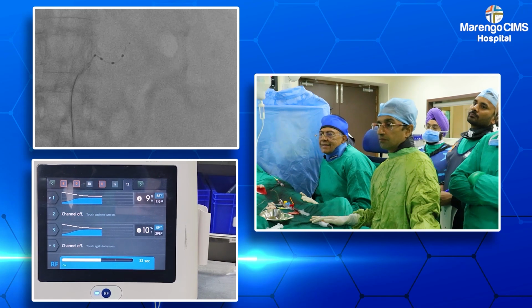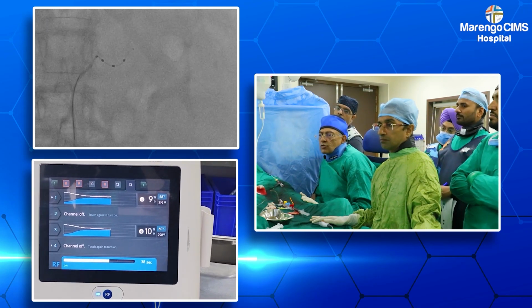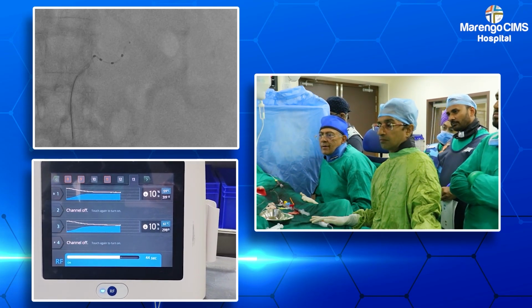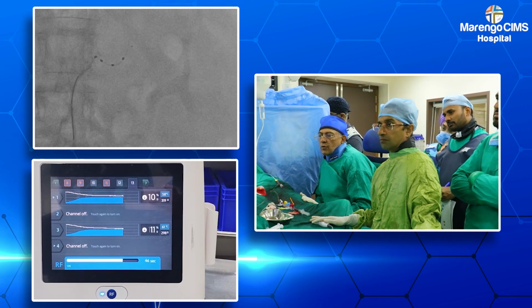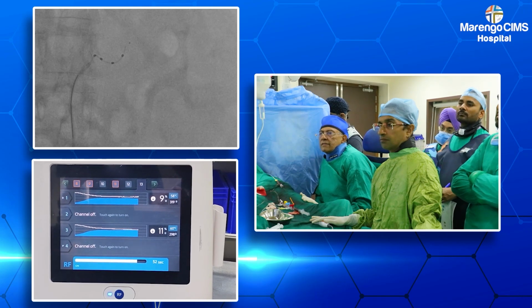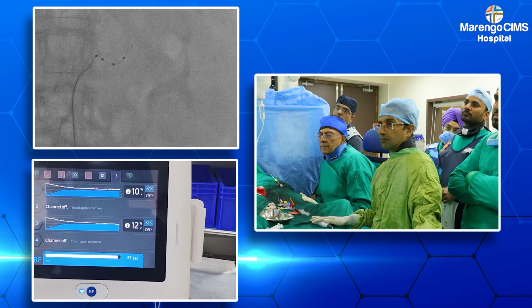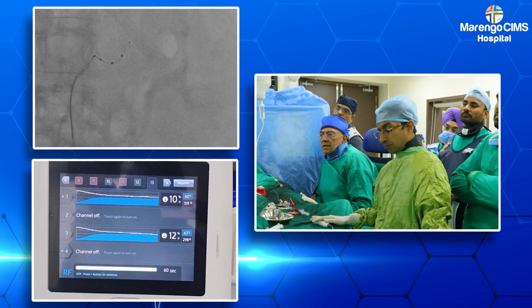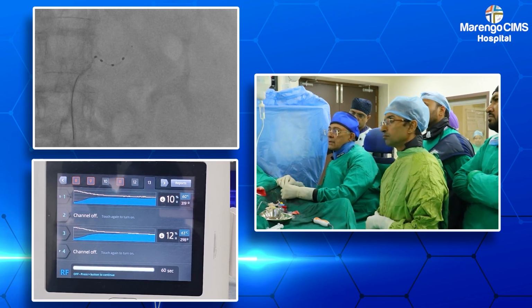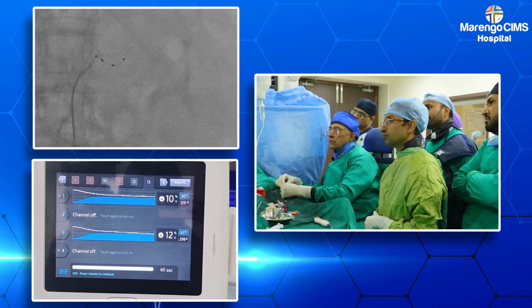The pressure which was running around 220 when we started the case has slowly declined to 150 systolic range. And during the ablation, it rises by about 10-20% even with the subconscious pain perception. This ablation seems to be going very well with adequate temperature rise, not over rise, and we are done. So we are done now, everybody. I will pull the catheter system out now and we'll do a check-in.